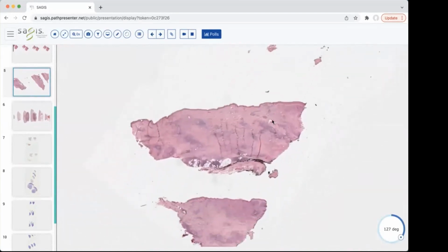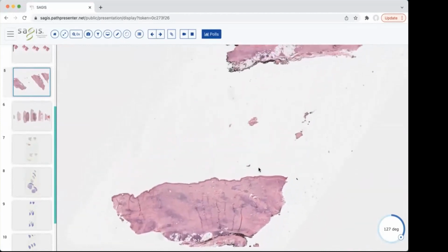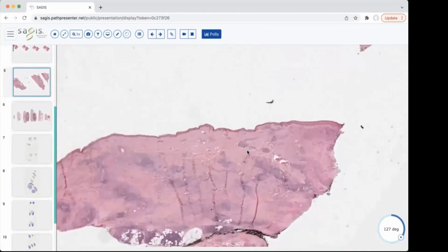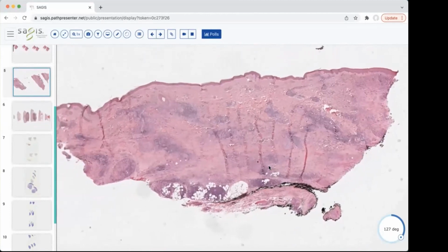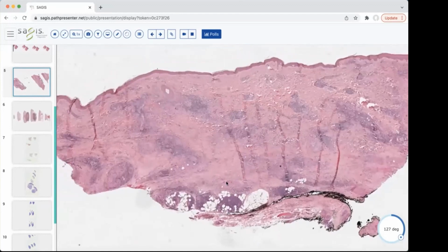This next specimen looks like possibly an excision specimen. It's very broad. They inked it as well. There's black ink at the edge here, coming up onto the specimen. And again, if you're newer to dermpath, this might be tough to commit to saying that this is a granulomatous infiltrate immediately at this low power. But with time, that will become a little bit easier.